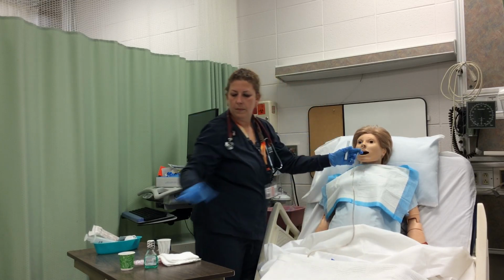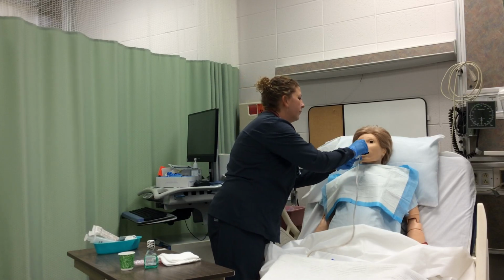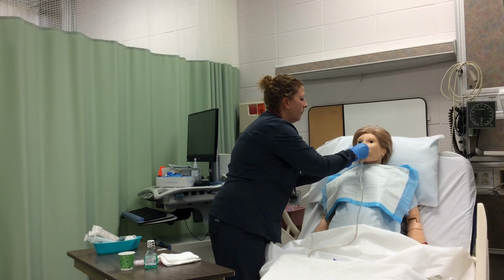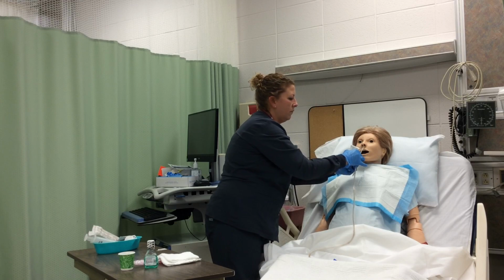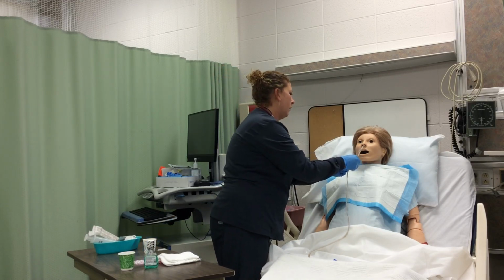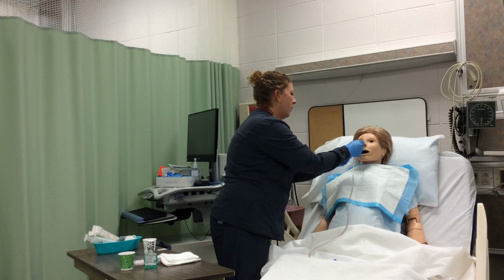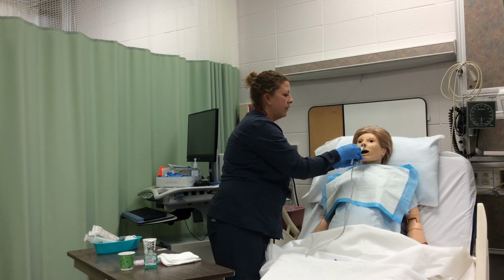If drinking water is not contraindicated and the patient prefers, provide small sips of water along with encouragement to swallow as the tube is inserted and advanced. Advance the tube as the patient swallows. Emphasize that the patient needs to mouth breathe and swallow throughout the procedure. And the tube is up to the place where I have marked.